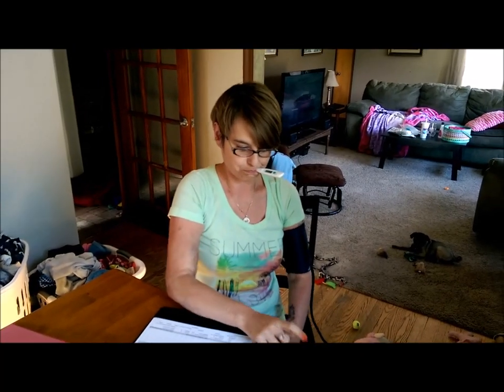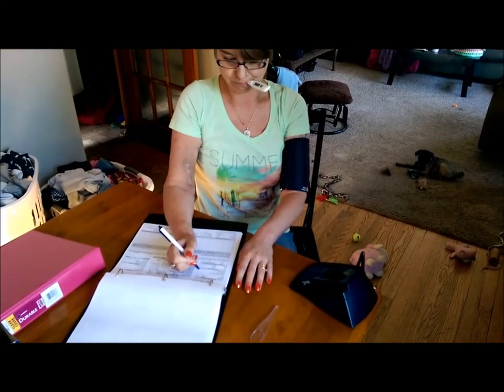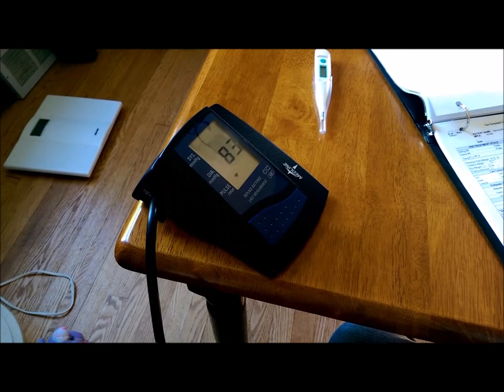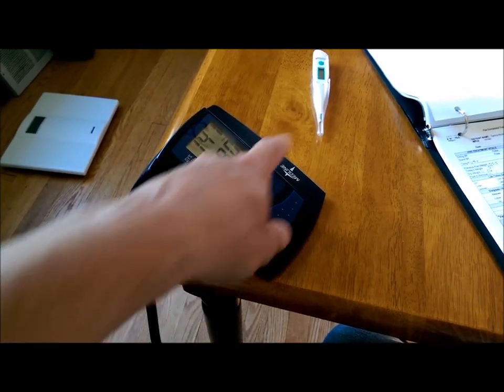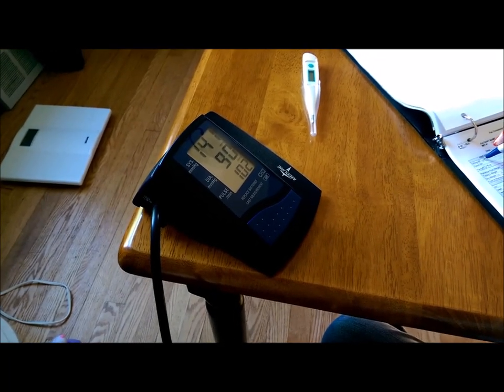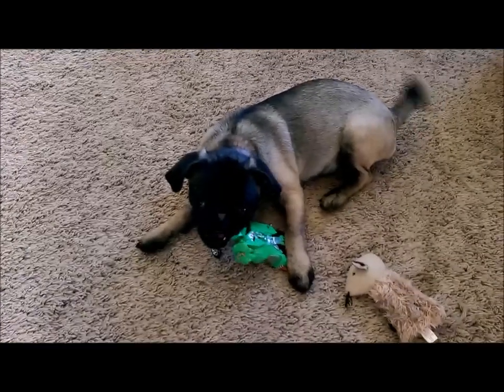For each treatment, Tammy has to take her vitals — temperature and blood pressure. Almost everything you see in this video, including the little stuff like this blood pressure machine and even the thermometer, is all supplied by the supply company.